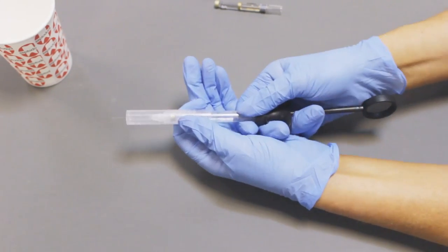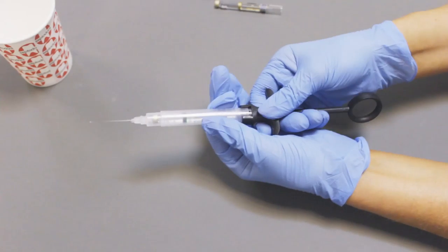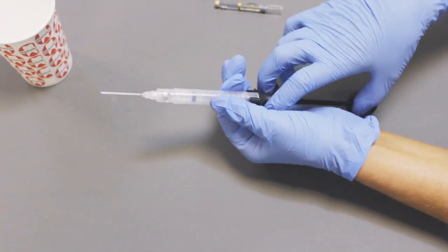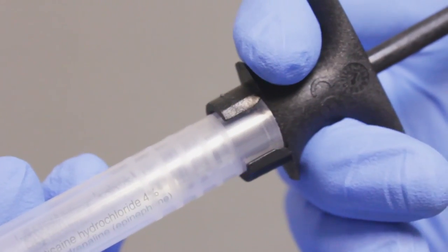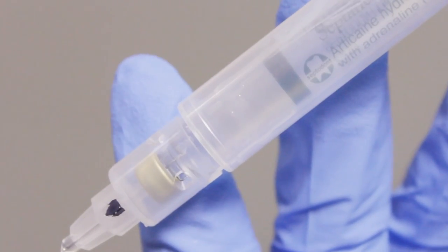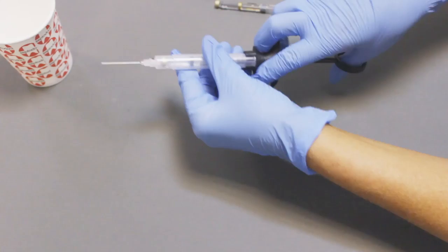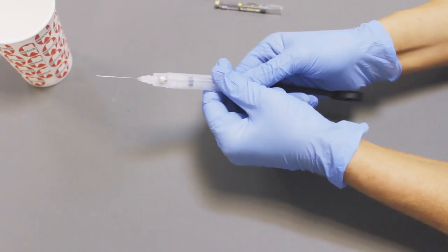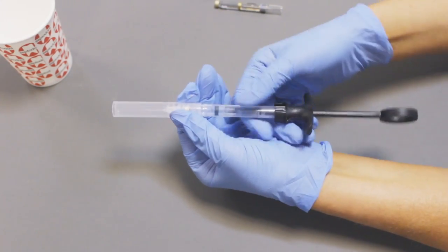A second injection can then be performed by repeating the first stage. When the operator has finished giving the local anesthetic, they may slide the protective sheath into the holding position and then pull one more time until a loud click is heard.